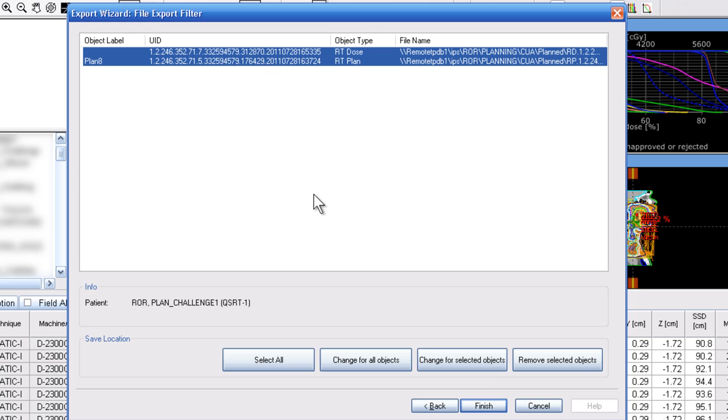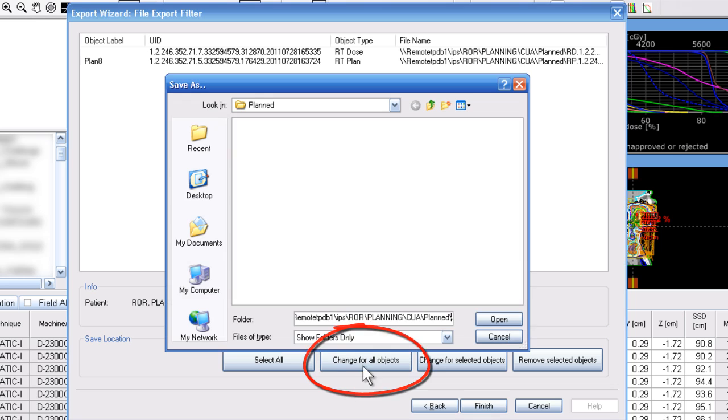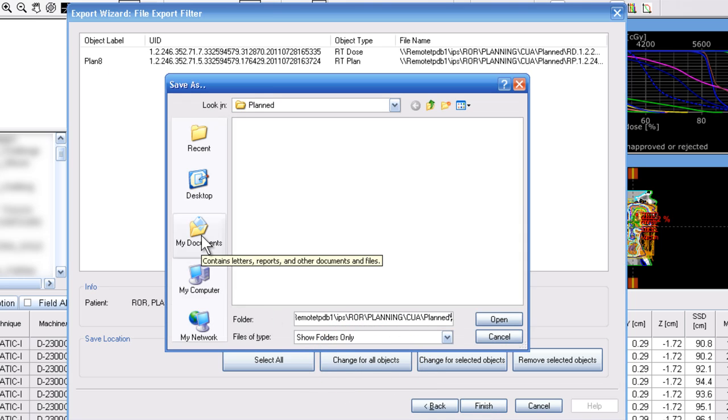Before clicking finish, depending on where your DICOM media file export is pointing to in the configuration, you might want to make sure that you're sending it to a place that you're going to find or that doesn't get automatically exported somewhere you don't want it. You're going to want to select change for all objects and then navigate.